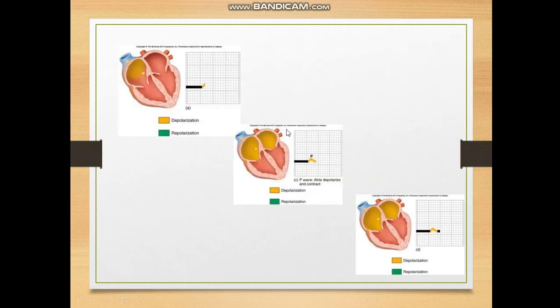See, this is how the depolarization is the yellow and repolarization is the green. See, this is how the pacemaker is depolarizing. And this is the baseline and wave formation. Because the depolarization is going towards the positive, yes, this is depolarized and it's a P wave.